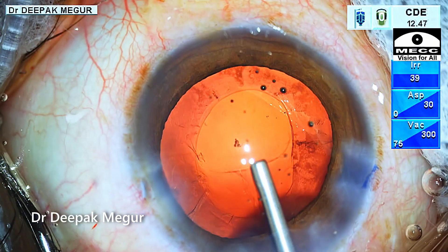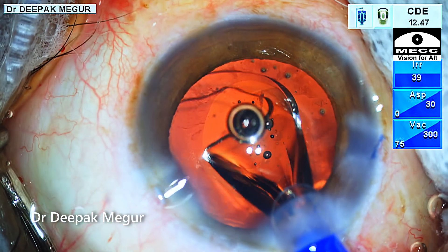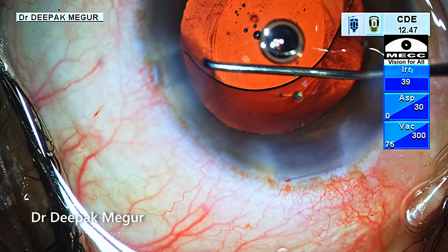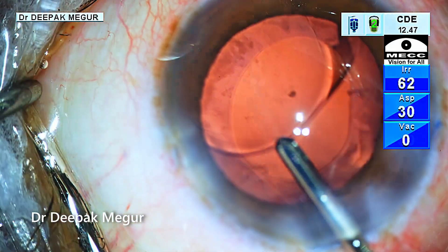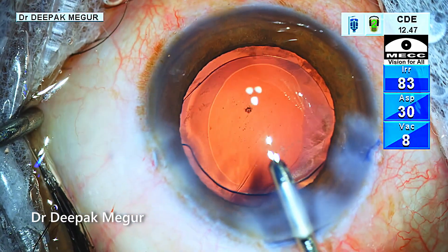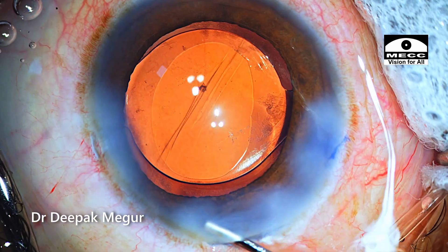The capsule is cleaned by gently flushing out the remaining sticky cortex. Once the cortex is out, the bag is filled with OVD, then the IOL is placed into the bag. OVD is removed from under and above the lens, again using a very low bottle height. Finally, stromal hydration is done. That's it — the case is done.